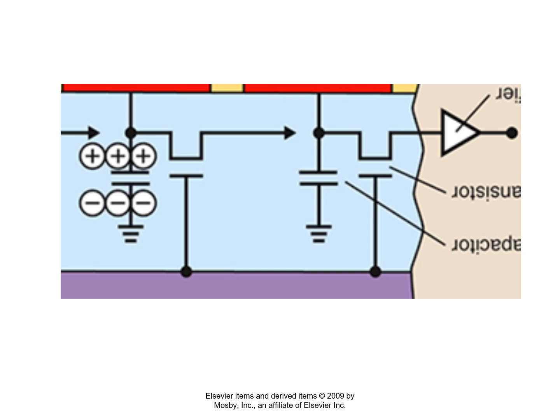Okay? The ground supplies and donates charge as necessary by what you would call, in a capacitor, static voltage or Coulomb force. And so it's only enough to balance what's being held, but it's not enough to keep it there once a stronger external motivator is applied, and that's applied at the gate electrode.